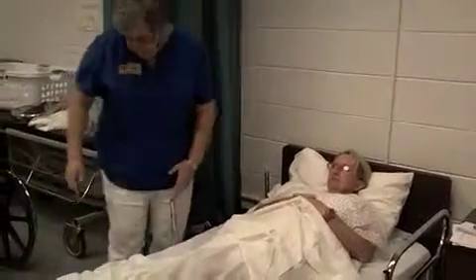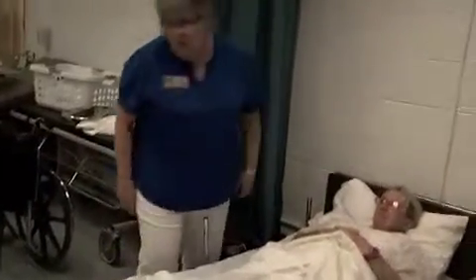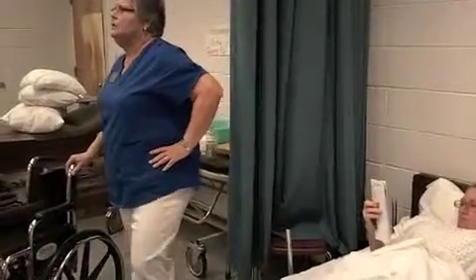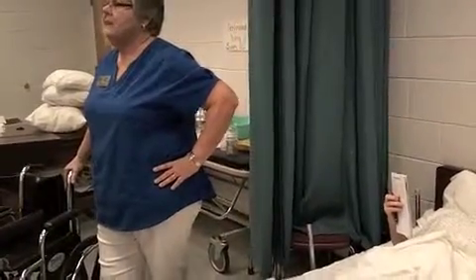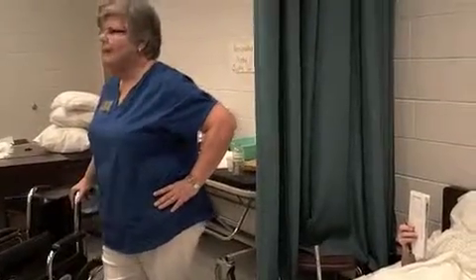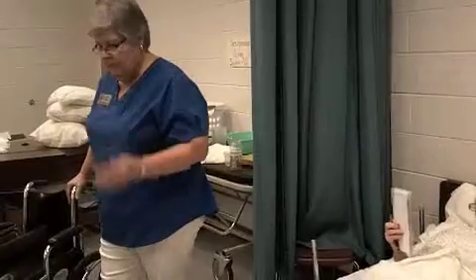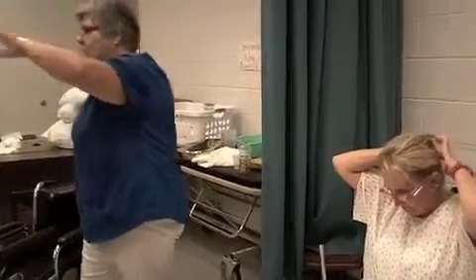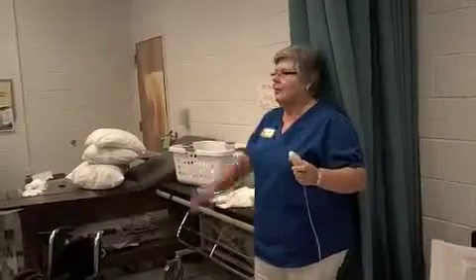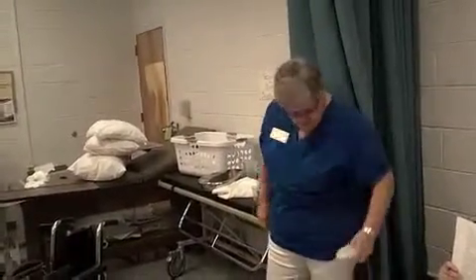Hey girl. My name's Agnes. I know you tired of seeing me, but we've got to get out of here. We'll be in the wheelchair, okay? This is what the instructions say — this is the little scenario going back to what you asked earlier. It says you need to assist this patient to get from the bed to the wheelchair. They need assistance to stand and to pivot. After you get them up in the wheelchair, they are going to remain in their room — like you're getting them up to sit there and watch the stories or listen to the radio. The reason they say to stay in your room is because they want to see the candidate give them the call bell. So that's why they say stay in your room — they're looking for them to give the call bell.